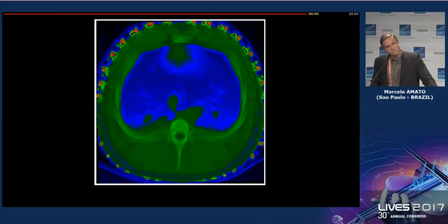I think there's a problem with that, because the ventilation and the perfusion themselves get reconstructed in a different way during the EIT reconstruction, because we have positive and negative impedance changes. So we could maybe get a shift between ventilation and perfusion. So we might observe shunt where there's no shunt, or dead space where there is no dead space. So what kind of reconstruction are you using to prevent this?